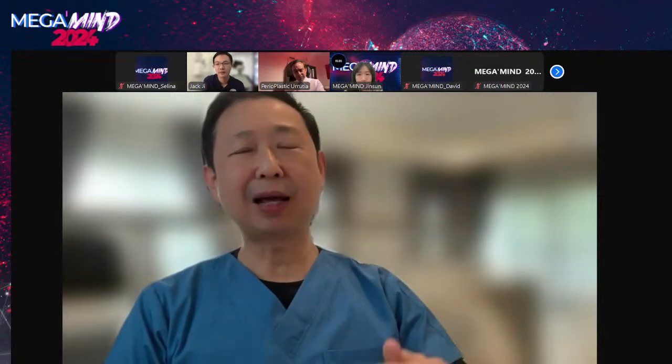Okay, thank you. So do you mean that you use the implant like tenting for the second bone graft? Yeah. I didn't put the picture, but I always put a 2 millimeter healing abutment to gain more height. So the titanium mesh is the support of the collagen membrane, and then the 2 millimeter healing abutment on the implant helps me gain more bone in height in the vertical aspect. So that's the reason we did it for the patient.